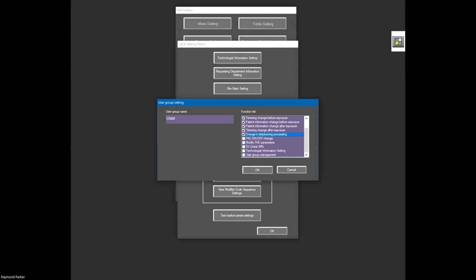Usually, that's going to prevent them from having virtual grid control. When we start the FDX console, you'll see that with the FNC button, there will be a VG in that QA function. And if this is turned or left off, the technologist would not be able to adjust virtual grid. So definitely these two I do turn on so that the technologist has control over virtual grid.